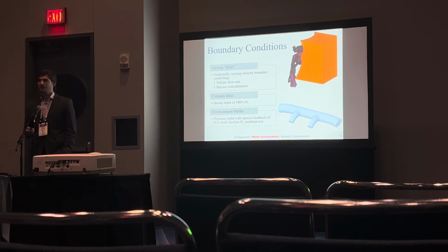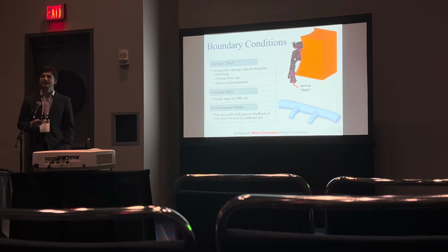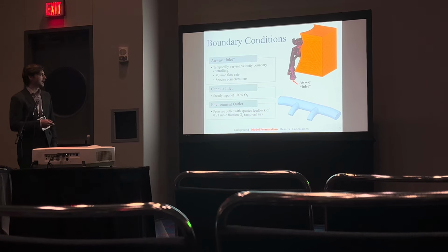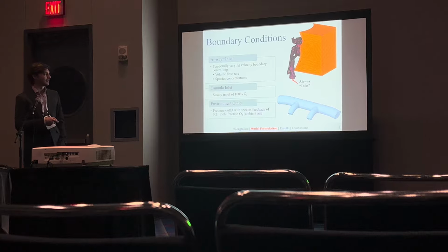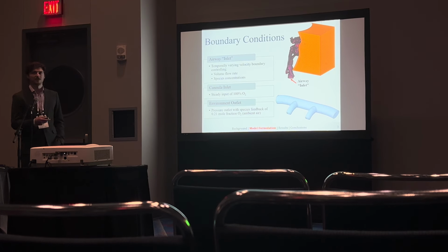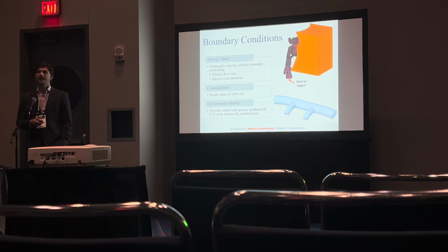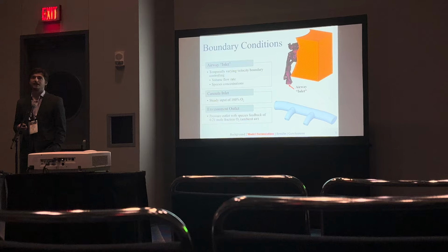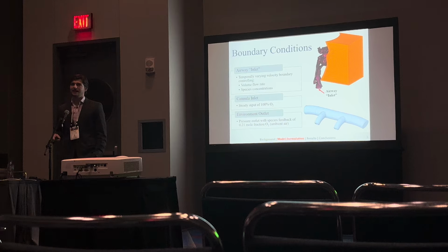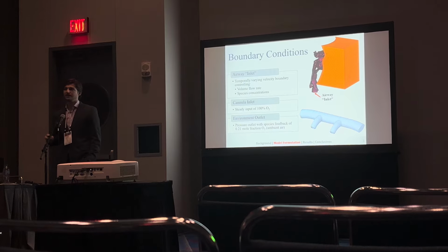Quickly going over the boundary conditions for the model. First, we have the airway inlet. Now, inlet is in quotes because it functions as both an inlet and an outlet, depending on where we are in the breath cycle. This was a transient model, and we applied a breath cycle using a user-defined function at the tracheal inlet/outlet there. Now, this controlled volume flow rate, so setting where you were in the breath cycle, but also species concentrations. So during the inhalation period, the UDF would track the species concentrations leaving the domain via the base of the trachea here, and it would accumulate the total volume of inhaled species during the inhalation cycle.